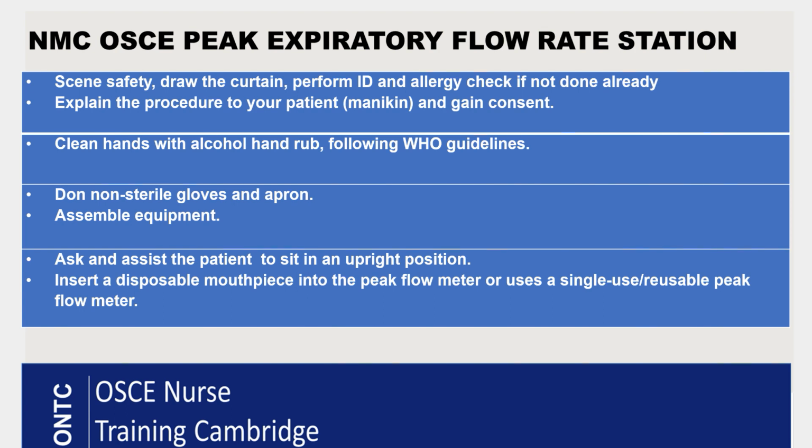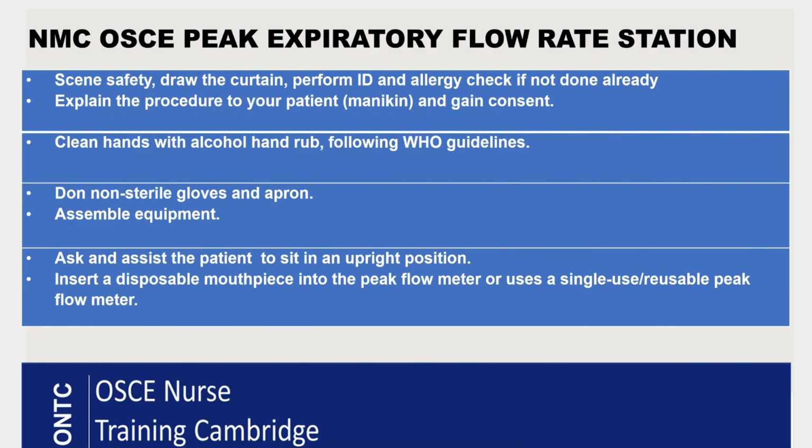Now you're going to inform your patient that you're here to do their peak flow reading, which checks your lung capacity, and ask if it is okay to go ahead. That's informed consent. After that, you're going to clean your hands as per WHO guidelines, and don normal clean non-sterile gloves and an apron. Then you're going to prepare all your equipment. First, your patient is normally a mannequin in your exam, as they don't normally give you a real person for this station, and your examiner will be the voice of the mannequin.